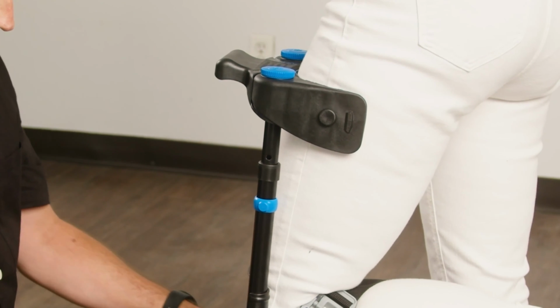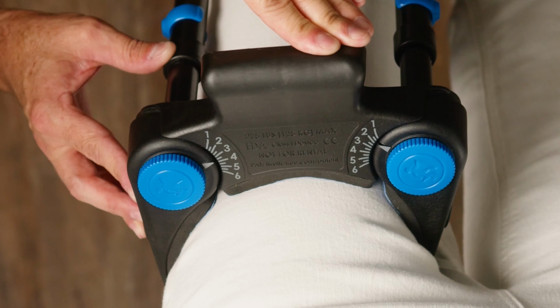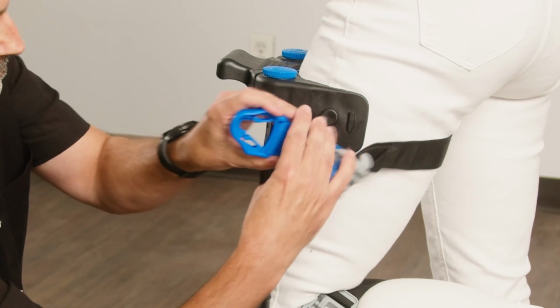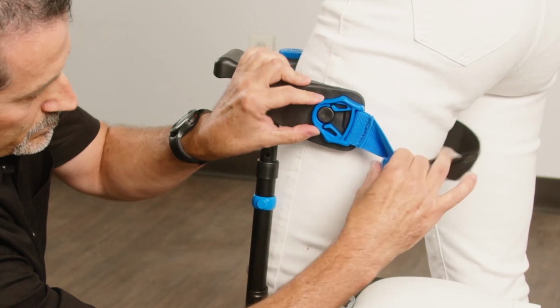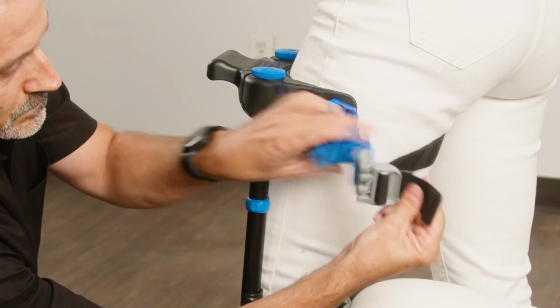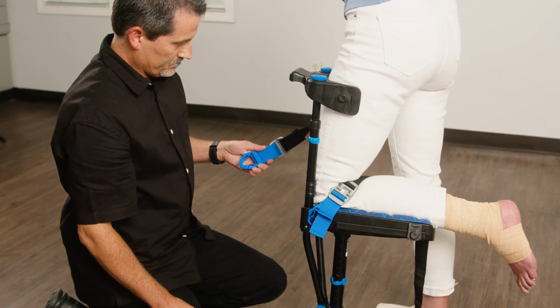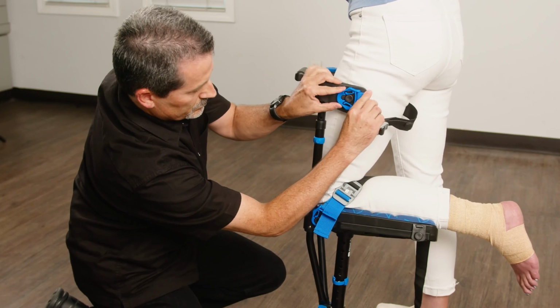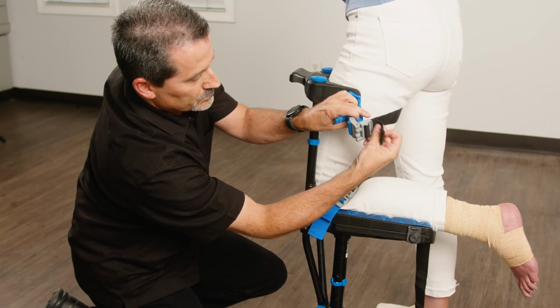Now, adjust and tighten the upper thigh strap. First, make sure there's no gap between the handle and the patient's leg. Then, bring the strap around the patient's leg and attach the blue buckle. A good trick to avoid getting too personal is to pull the strap downward while bringing it through the patient's leg. Reach around with your other hand, grab the strap, and finish by fastening the blue buckle.